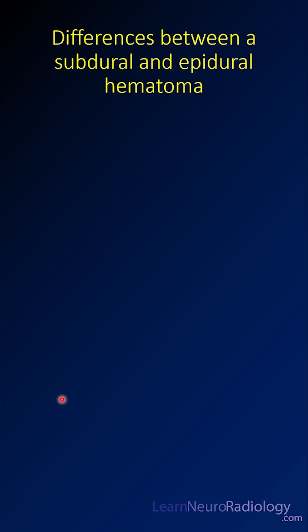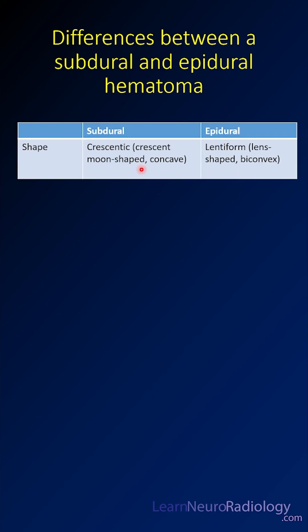Let's take one quick minute to learn the key differences between the imaging appearance of a subdural and an epidural hematoma. A subdural hematoma tends to be more crescentic, shaped like a partial moon, whereas an epidural hematoma is more shaped like a lens, so the outer margins bulge outward.